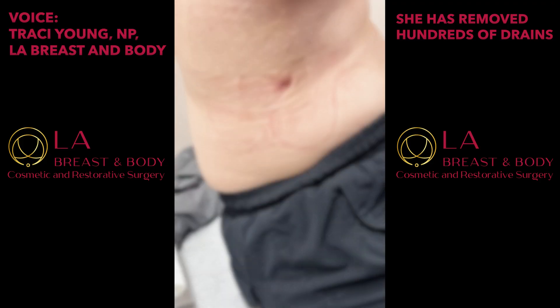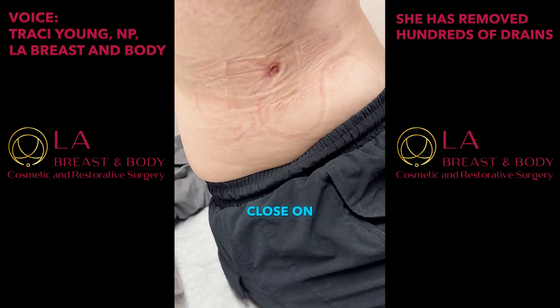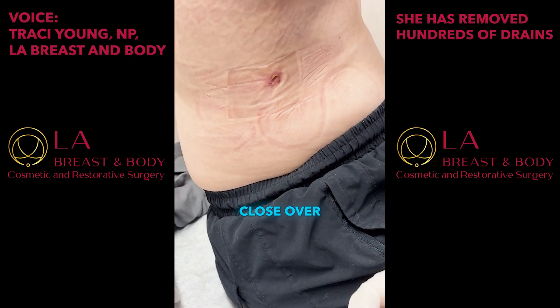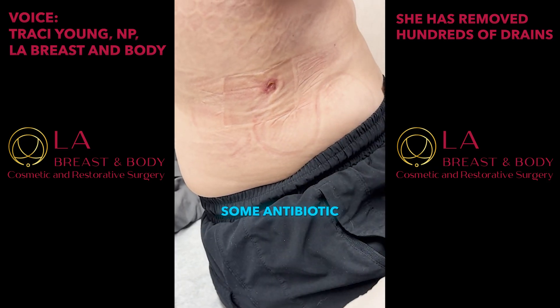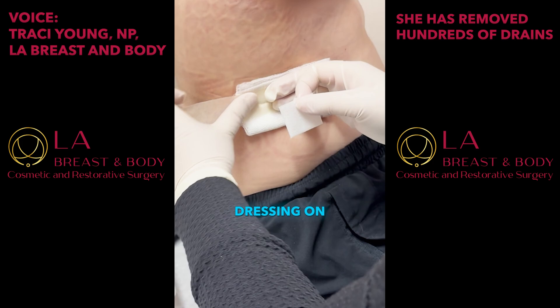The drain has been removed. This drain site will close on its own within the next few days. The drain track will close over the next 24 hours. Cover with some antibiotic ointment after showering daily, and put a dry dressing on there.